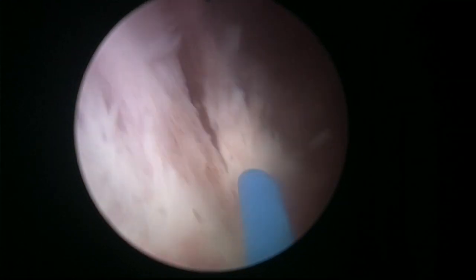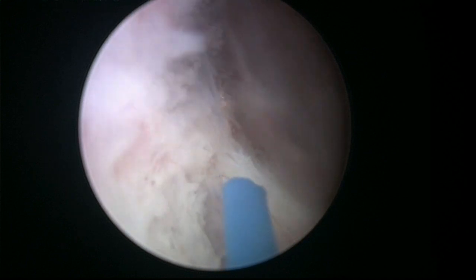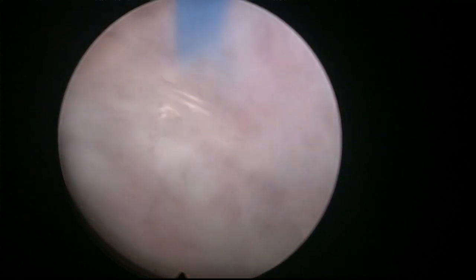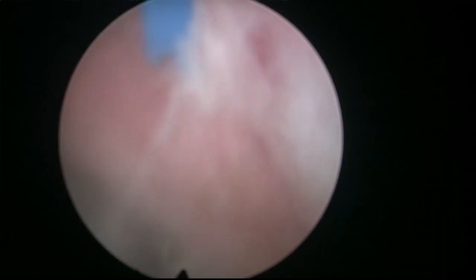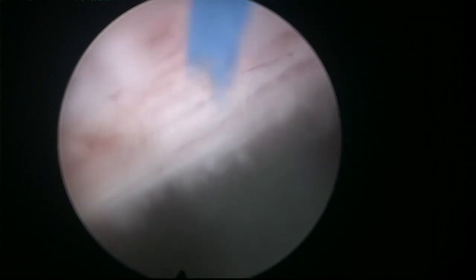This operation probably took longer than usual. It was a little bit bigger prostate, but more because of the bleeding tendency. I don't know why. You see, there's some bleeding still. Let's see if there's any big vessel contributing to this. Sometimes when you coagulate these vessels, the visibility improves significantly. It's true that we didn't concentrate on the anterior prostate at the end, before tilting the adenoma.